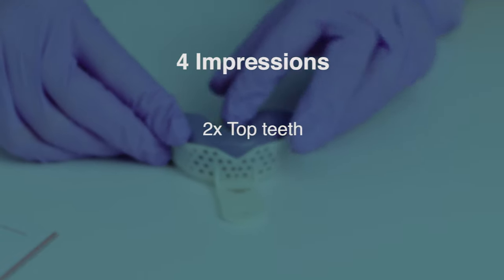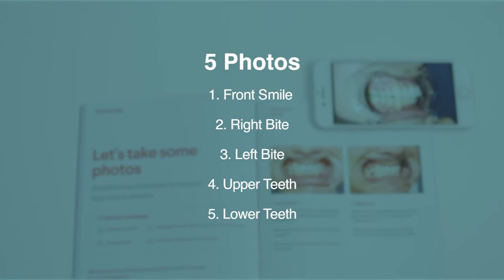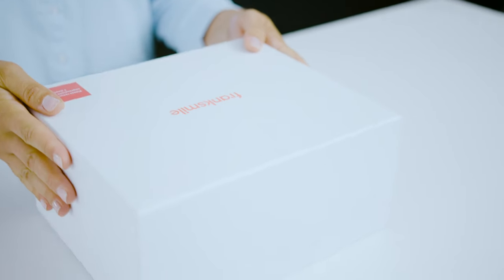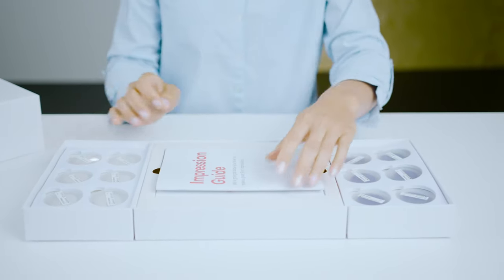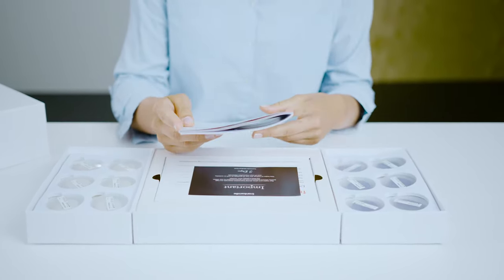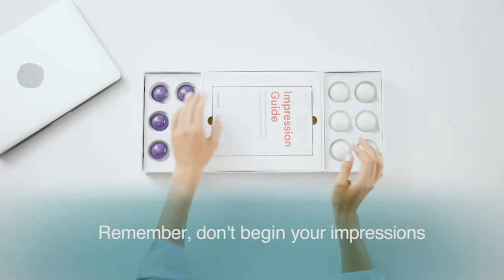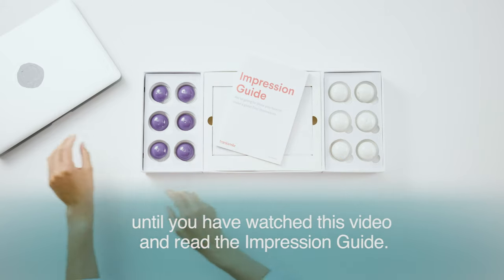You'll be taking four impressions — two of your top teeth and two of your bottom teeth — along with five total photos. We'll walk you through your first impression, but start by watching this video and reading the manual all the way through, then rewind and follow along as you do each impression. Remember, do not begin your impressions until you have watched this video and read the impression guide.